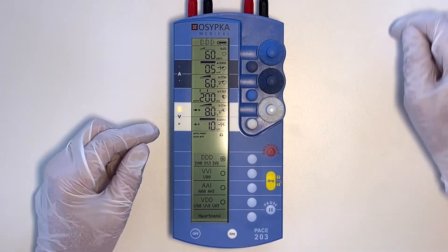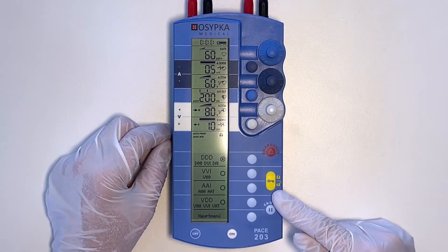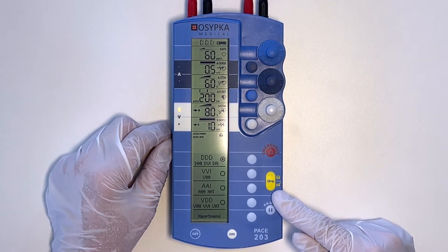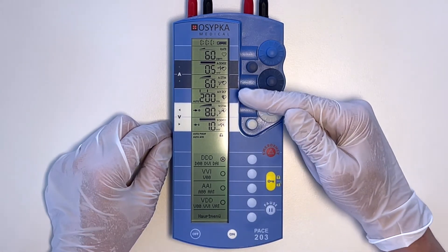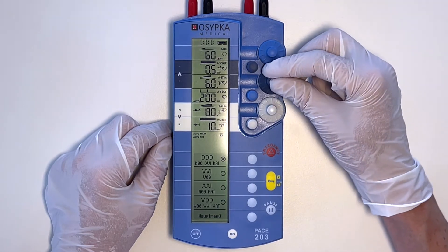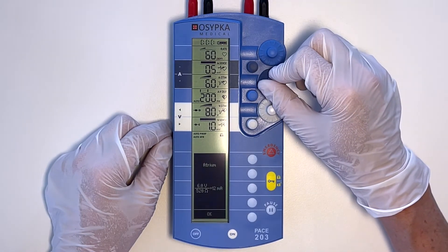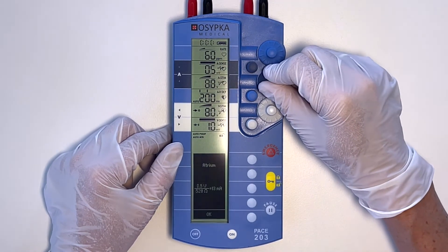The second thing you need to know is the yellow button. This button is there to unlock the device. None of the parameters are changeable unless you unlock the device first. For example, if you try to change the rate, you can't — you have to unlock the device first. If you don't do anything with the device for 30 seconds, it will lock automatically.